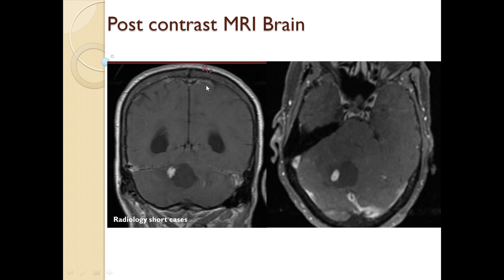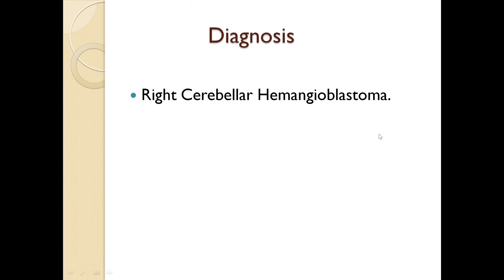On post-contrast coronal and axial T1-weighted images, the cystic lesion is non-enhancing and the peripheral mural nodule shows homogenous enhancement with a serpentine flow void at the periphery. Again on the axial T1 post-contrast images, we can see the homogenous enhancement of the mural nodule. Based on these findings, the diagnosis of right cerebellar hemangioblastoma was considered and was later confirmed on surgery.